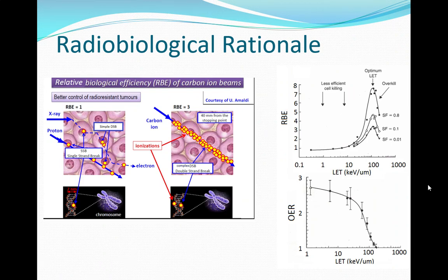So does that mean the proton is better? Proton is way better. They're not showing it hugely here because they weren't pushing for protons. They were pushing for carbon, so they didn't want to draw it too nicely. Just know the bias of the people who are drawing the graphics. Protons, like heavier ions, will generate a decent number of double strand breaks, much, much larger than X-rays. If you were really to do an honest job of X-ray interactions, you wouldn't be able to show across these cells this many breaks for a single photon.